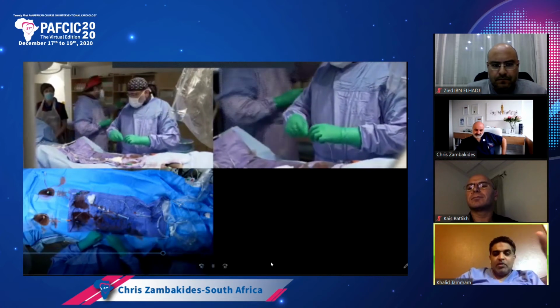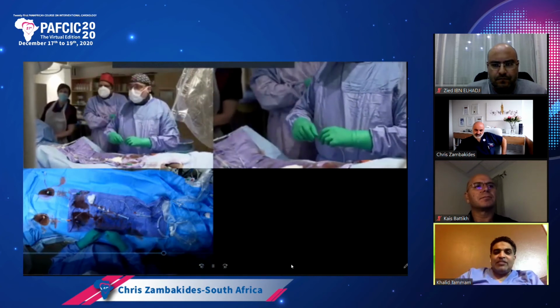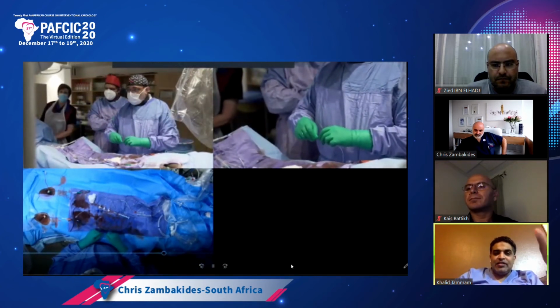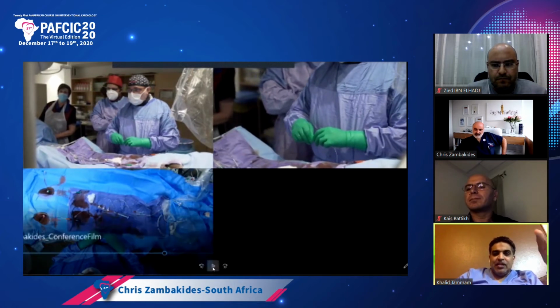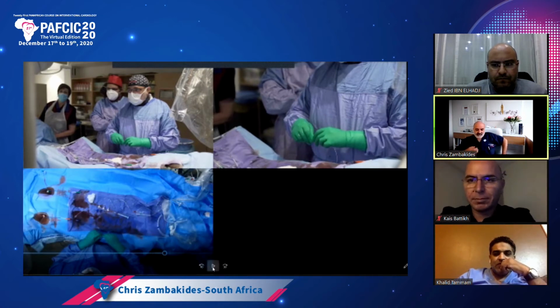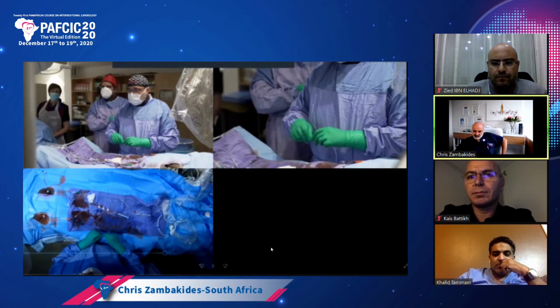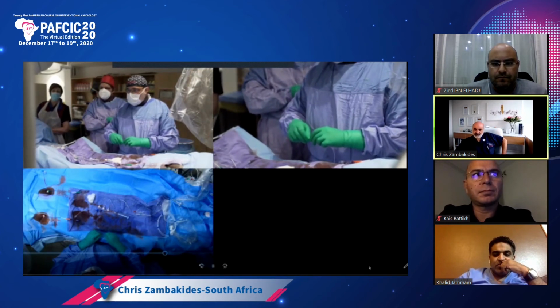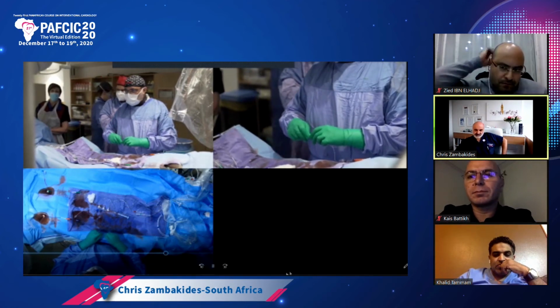Because we don't see the angio clearly: the RCA stent is still until the crux, the CTO segment inside the stent is before the crux or the middle thing? No, so the stent is about half a centimeter to a centimeter before the bifurcation. So it's in the middle of the CTO segment. You'll see now, sorry, I'm not sure why they didn't put the video, but I mean the angio, but you'll see the angio in a minute.